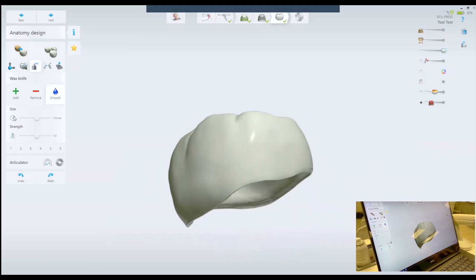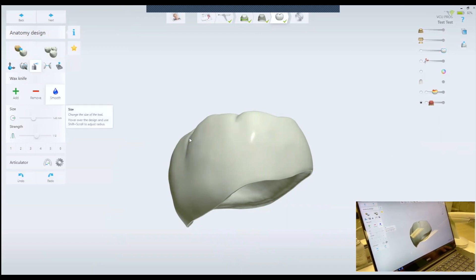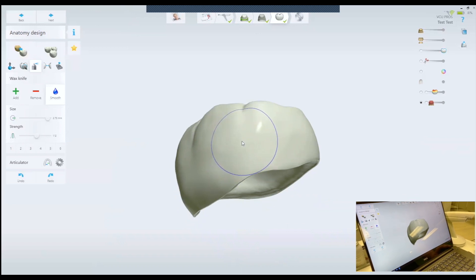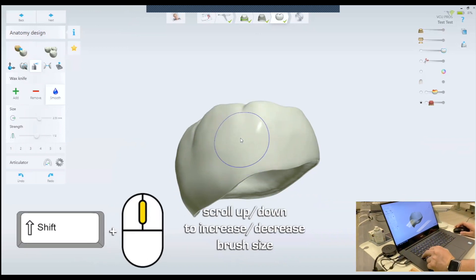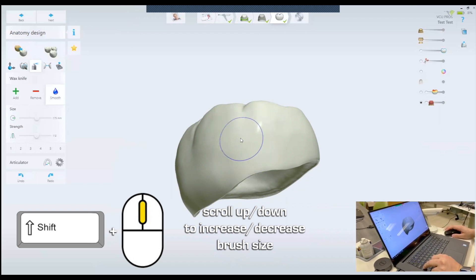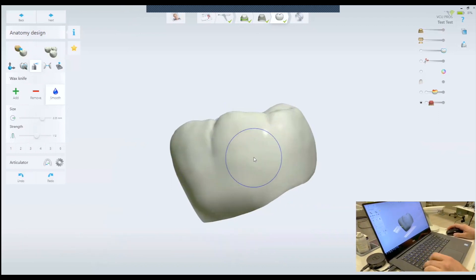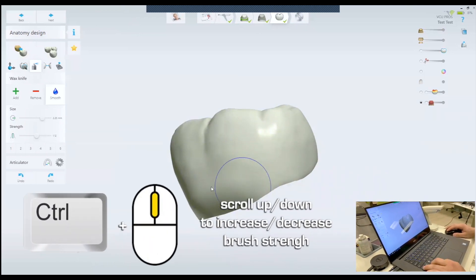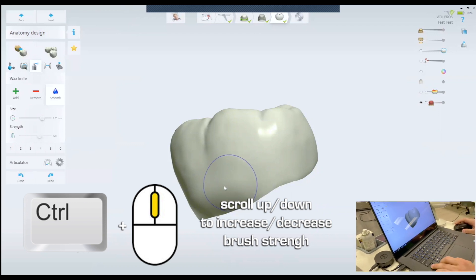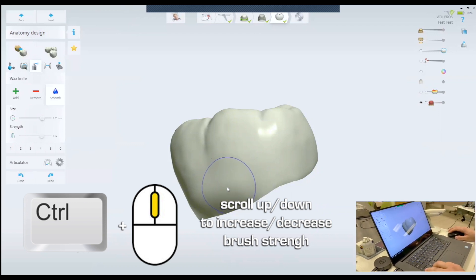Now I'm going to use the smooth tool. This is the size of the brush. If you want to increase the size of the brush, you can use this tool and enlarge or decrease it. To do that on the keyboard, hold the Shift button and the scroll wheel to change the size. To change the strength of the brush, you use the strength tool here, or press Control and the up and down mouse wheel.